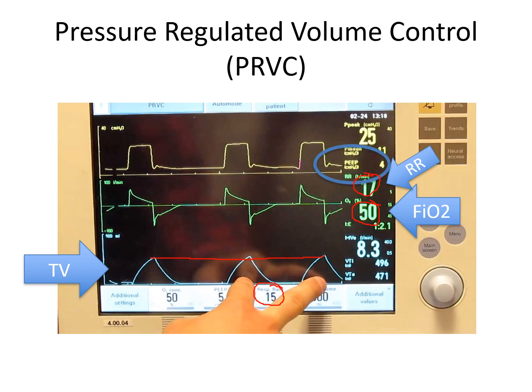And we have a PEEP. So again, if you're looking here, this is our setting of PEEP. Right here, it looks like about 4. And if you can see right here, this is where your PEEP is. What that is doing is giving you the positive end expiratory pressure. The next thing we're going to look at is your inspiratory time. So this is how much time that you're in the flow rate of what you're delivering the air in. And you can see that there is an IE ratio of 1 to 2.1. So it's taking 1 second to go in, 2.1 seconds to come out.